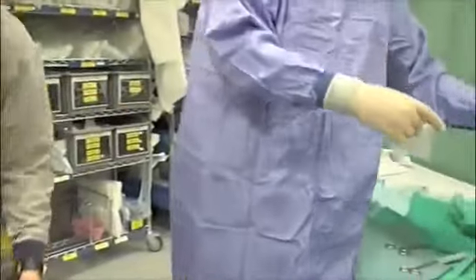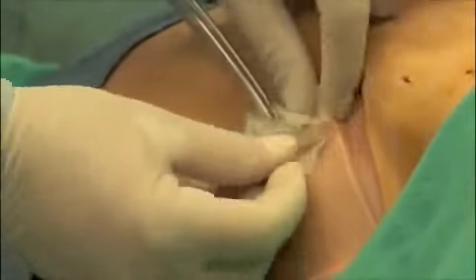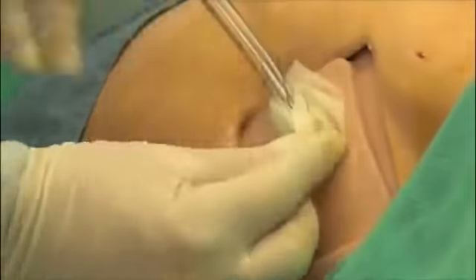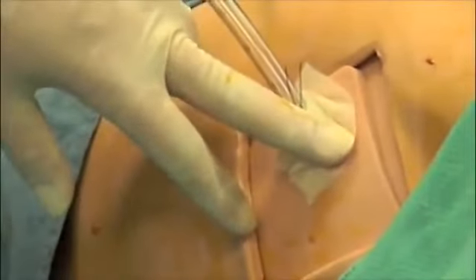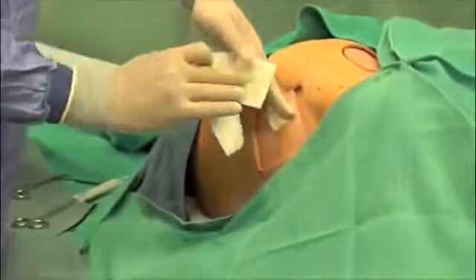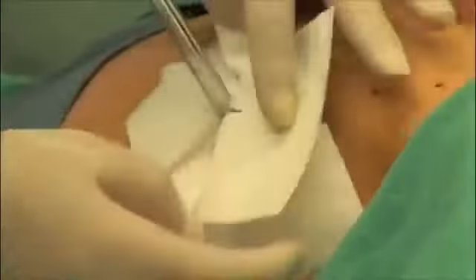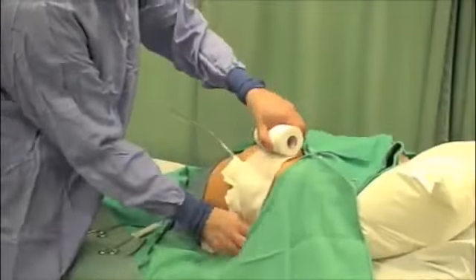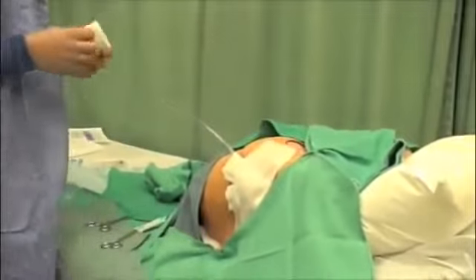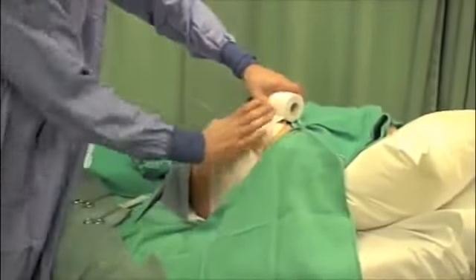Apply an occlusive dressing such as adaptic and drain sponges. Secure with MeFix. Tape the tube to the chest. A flexi-track may be used.